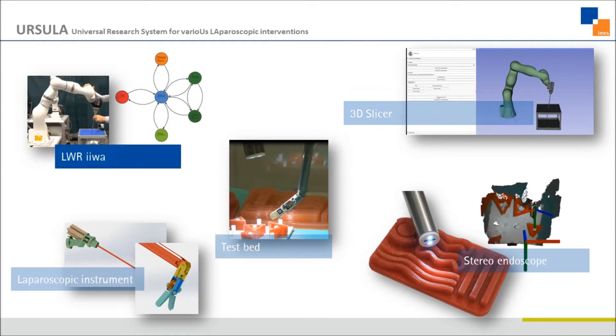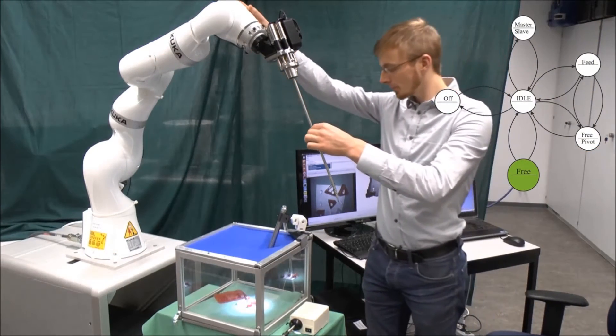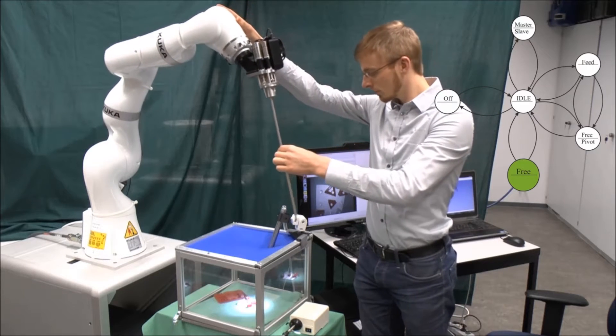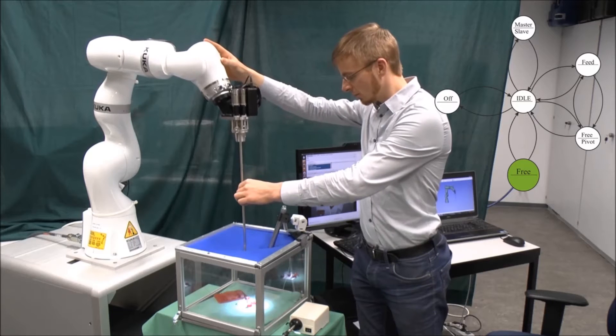For the use of the lightweight robot in robot-assisted surgery, we developed the state machine with different control modes. First, we would like to show a control mode where the user touches the robot and moves it freely in six degrees of freedom. This control mode can be used to insert the instrument into the patient phantom.